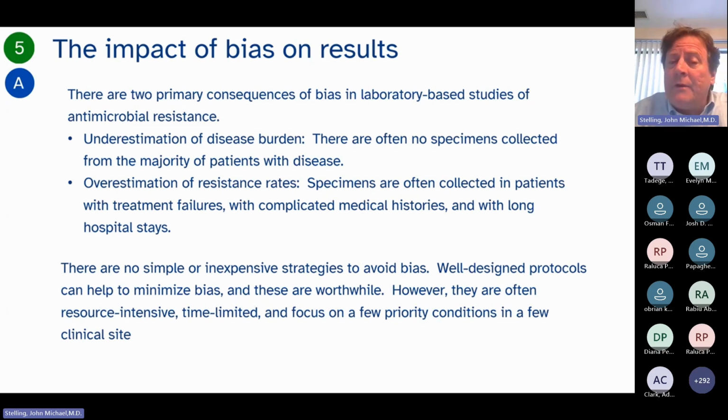So we might say very accurately that 30% of the bacteria in the lab are resistant to ciprofloxacin. And someone might think, oh, 30% seems like a lot of resistance. I shouldn't use Cipro. I should use imipenem, which only had 5% resistant. And that would be wrong. We don't want to jump to the reserve agents because I think Cipro would probably work. When I say 30% of the laboratory samples are resistant, that doesn't mean that 30% of the samples out in the general community are resistant. So surveillance of antimicrobial resistance does come with the risk that we may incorrectly state that resistance is too high to the first-line agents.